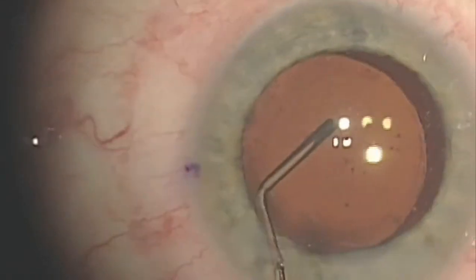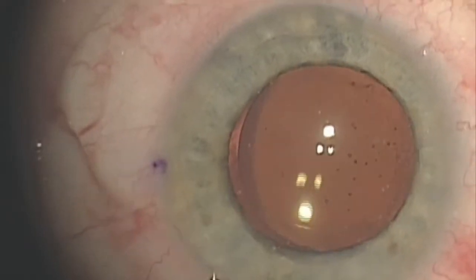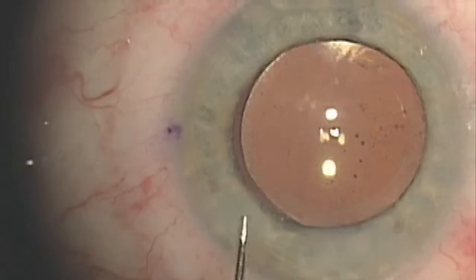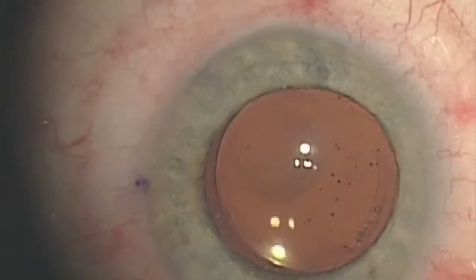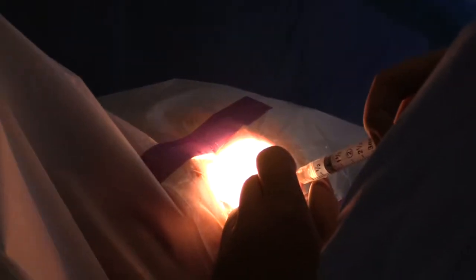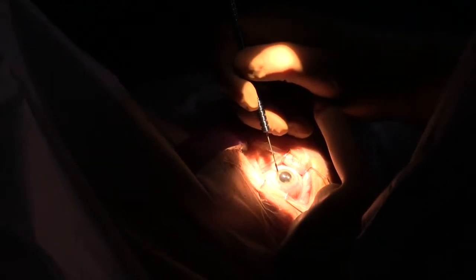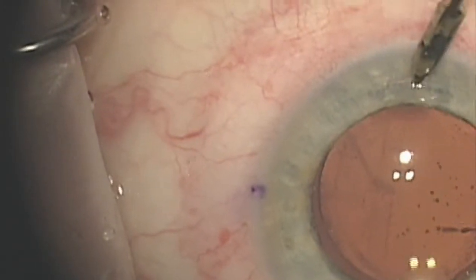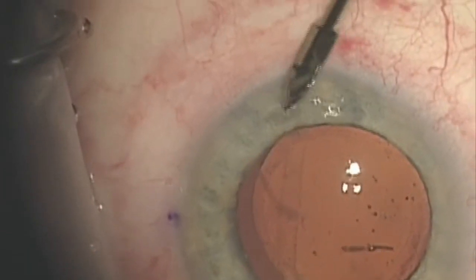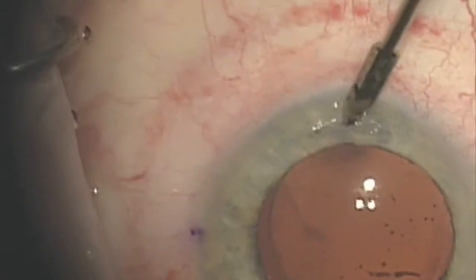Now we're going to go into this other, make sure this lens is centered. I want that centered like that, perfectly round. Stay in the bag, we'll hydrate this one. There, I want to come back in, I want to do the other again. Okay, I'm correcting the pressure. When you see my finger there, I'm checking to make sure that eye pressure is where we'd like it, and I'm going to make sure that arcuate is all the way open, so I'm happy with it. I may not put as much as I would like there. I think it will right there.